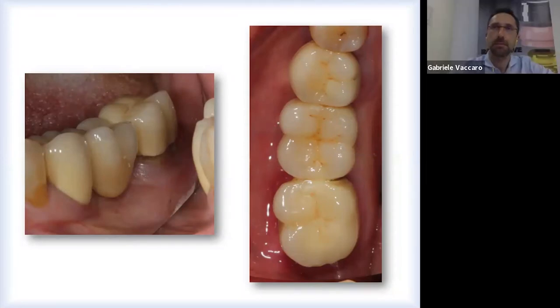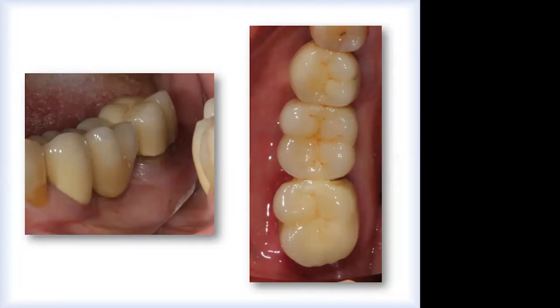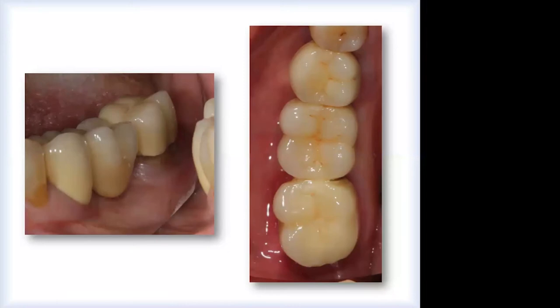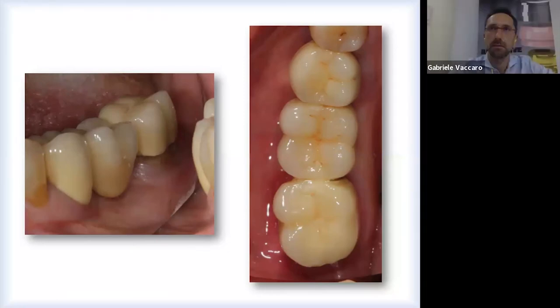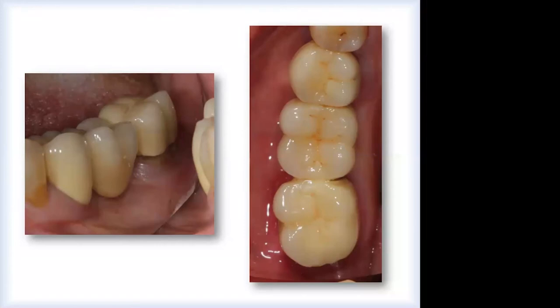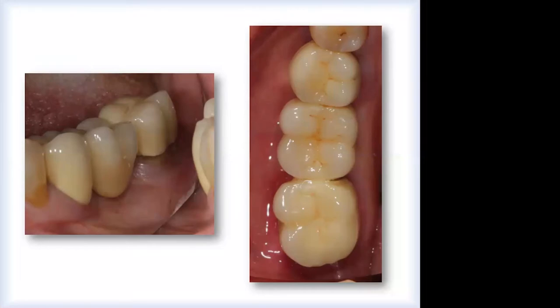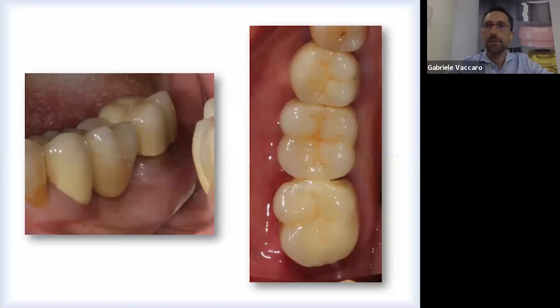Usually, the company invites people to respect the rules the implant company gives you. When the company gives you a torque value for tightening the screw, you need to screw it to the value the company indicated. It's true, doctor? Of course. Microphone.